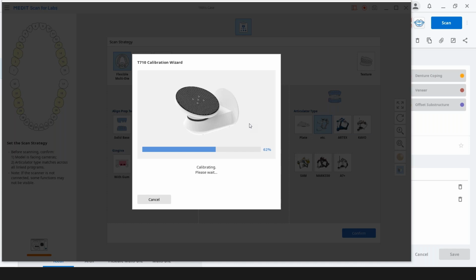I don't know if you can hear it, making its whining noises that are just normal. The gears are moving, but it is swinging back and forth, tilting the plate at different angles. The blue light is flashing and getting the readings off of the plate itself.